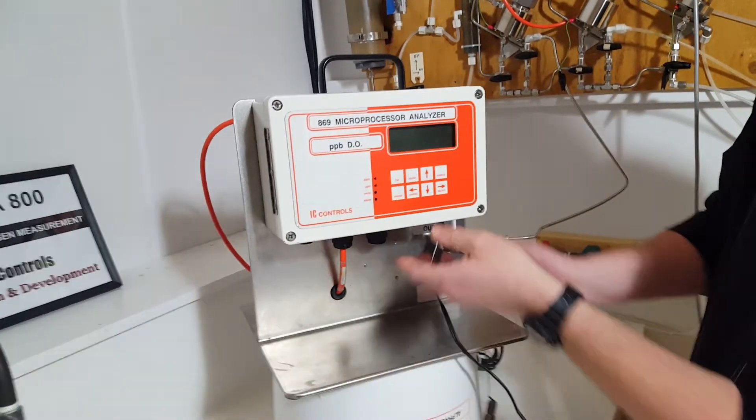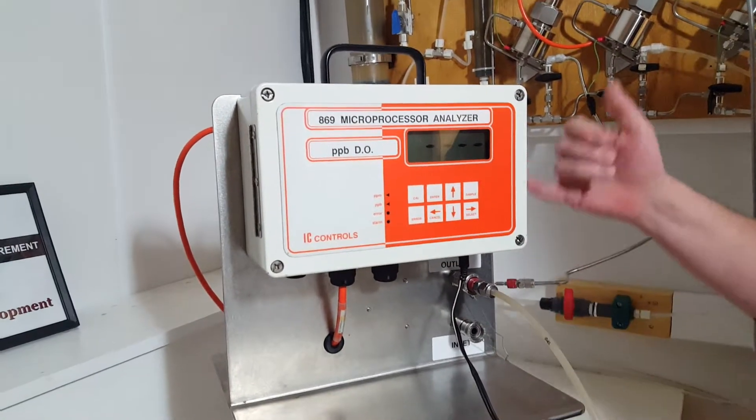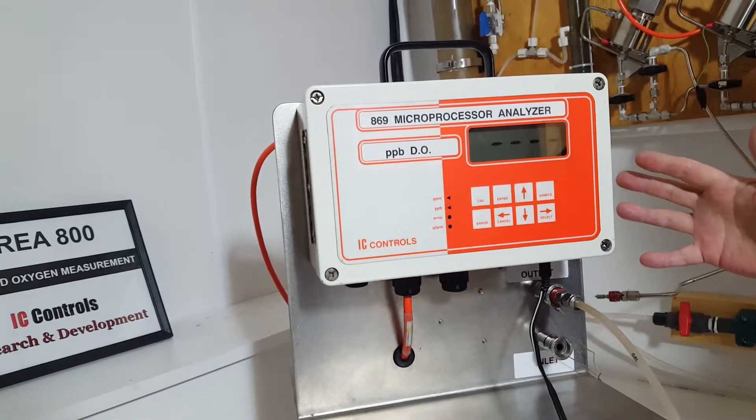We'll just power it on. There's a little button here, push power on. It's going to run through its boot up sequence, which takes 10 to 15 seconds to run through.